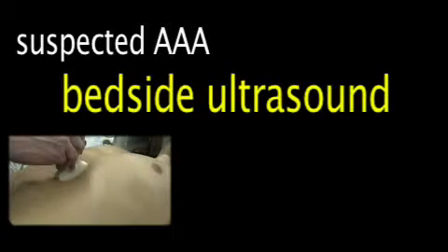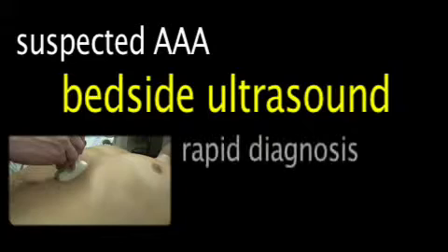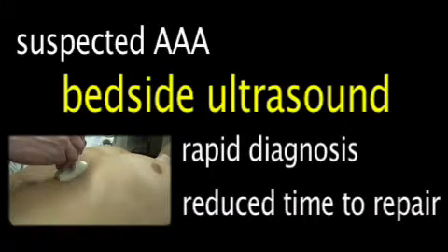In patients suspected of ruptured AAA, bedside ultrasound can be life-saving. It can be performed as part of the resuscitation, providing diagnosis within minutes and dramatically reducing time to operative repair.